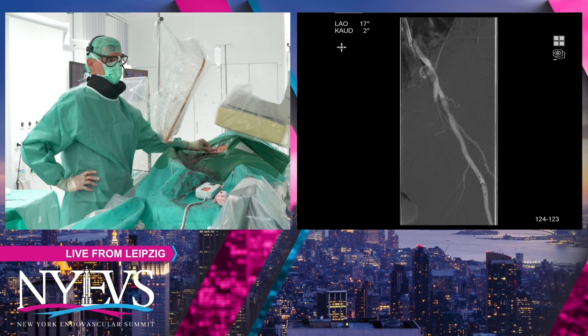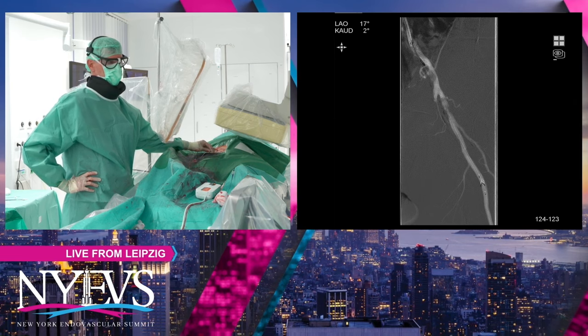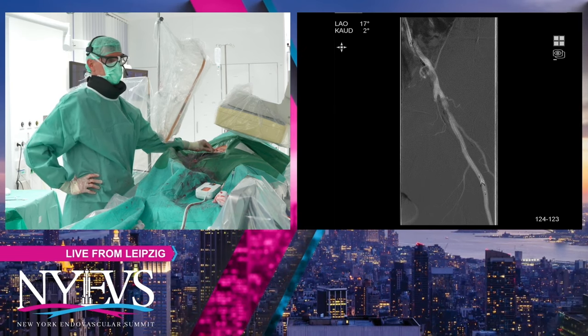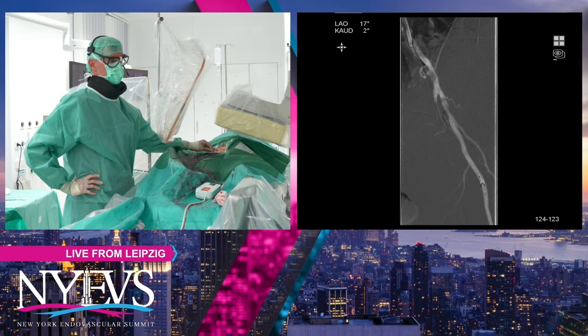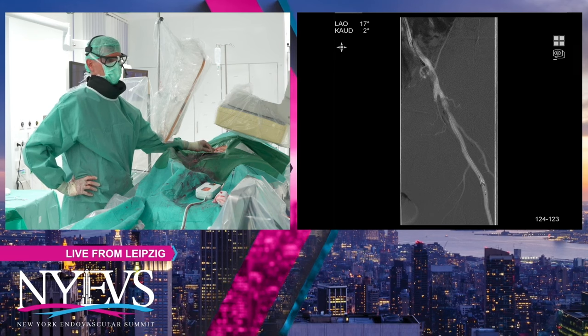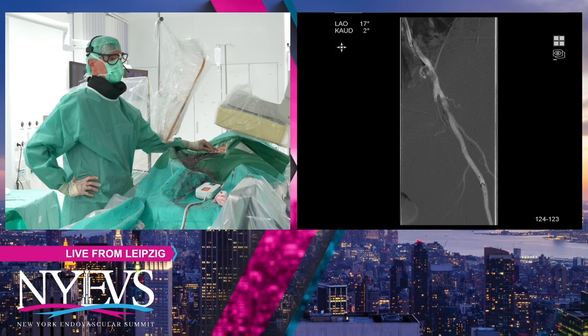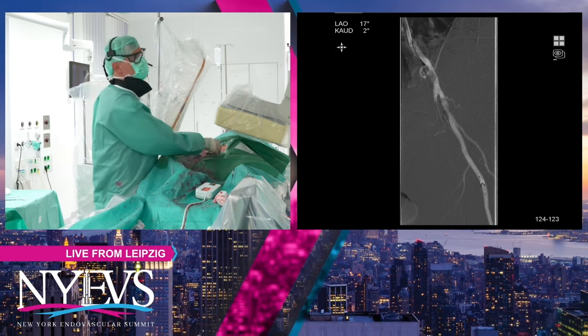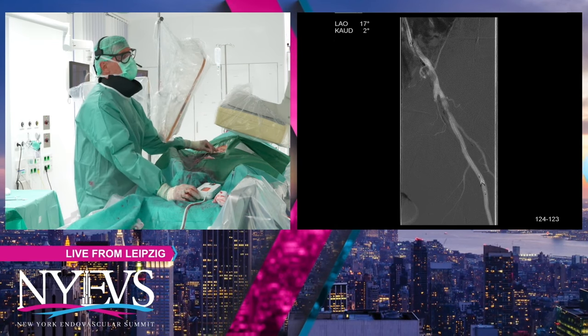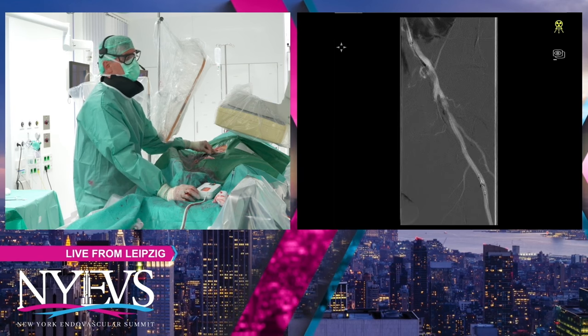At the end, I think there's maybe a little bit missing data, certainly about comparison of these two devices. And we have good results with atherectomy plus DCB. So therefore, I thought to go here for what I know better. Can you talk to us about your technique in this case? How you're actually using the Jetstream? Blades up, blades down, etc.